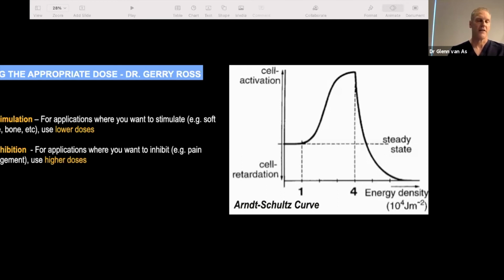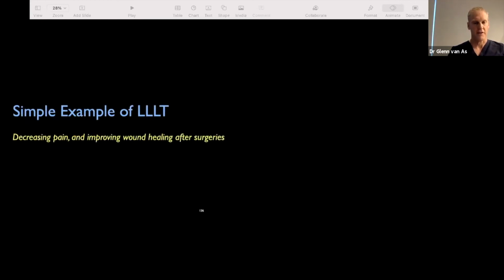If you really want to check to see if it's the case, those of you doing third molars, do one side only. Don't tell the patient. Get them back and say, hey, how you doing? Oh, I don't know why, but the left side hurts me more than the right. You do that a couple of times, and you realize that the right side is the one that you used the laser on. I know it's hard to believe for many people, but I'm telling you, it does work.